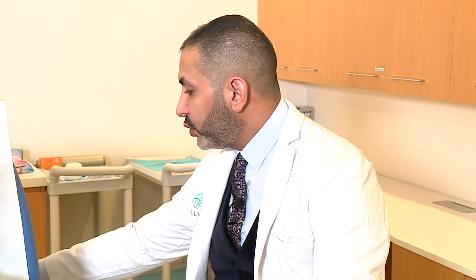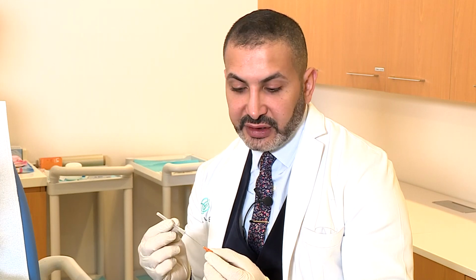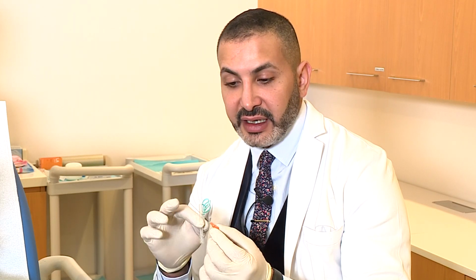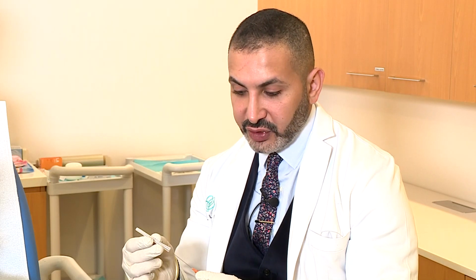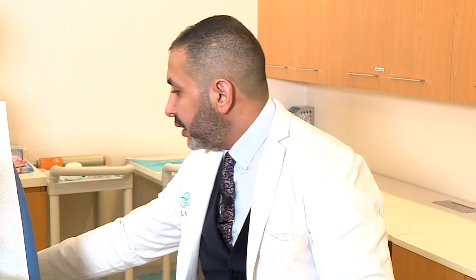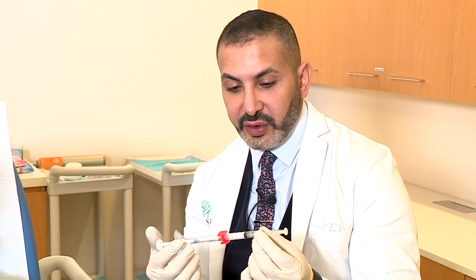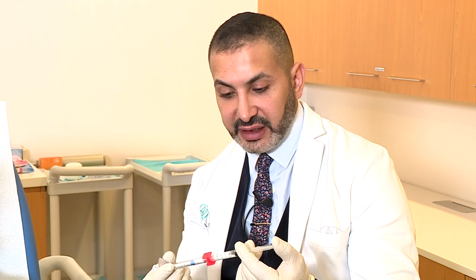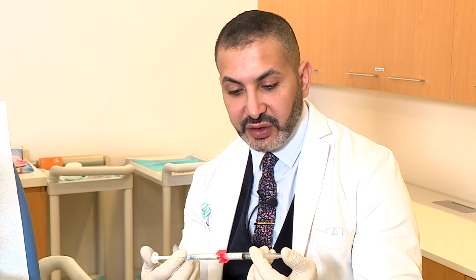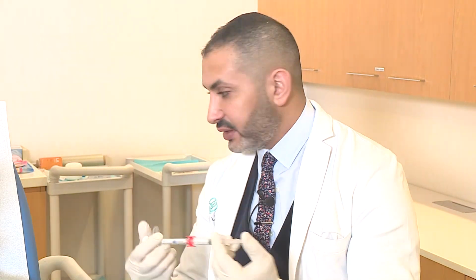The plane that we are injecting here is subcutaneous. We will be using a blunt cannula. This is a 25 gauge blunt cannula, almost 2.5 or 2-inch length, which can reach most of the areas. In the dilution, we use the connector in diluting the Radiesse with the 1.5 dilution, which is 0.5 lidocaine and 1 cc of normal saline, mixing it together in both, and then connecting it with the blunt cannula, and it will be ready to be injected.